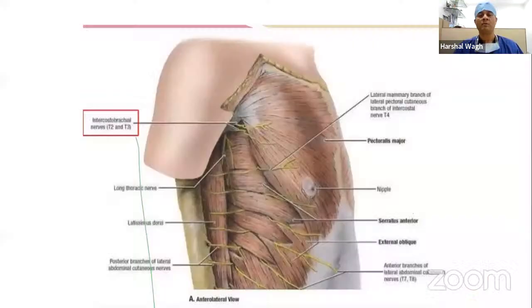So again, if I put an ultrasound probe in this position, it is going to be the pectoral block, the interpectoral. I'm going to put local anesthetic in this position between the pectoralis major and minor, which becomes the interpectoral block. Basically that is going to catch the medial and the lateral pectoral nerve. If I put my probe here, I'm going to see the lateral edge of both the pectoral muscles, and I'm going to see the ribs, and the serratus anterior sitting on top of the ribs.